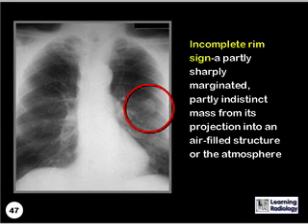What is the name given to this sign? This is the incomplete rim sign, a partly sharply marginated, partly indistinct mass from its projection into an air-filled structure, such as the lung, or the atmosphere. In this case, this was a large mole on the patient's skin.